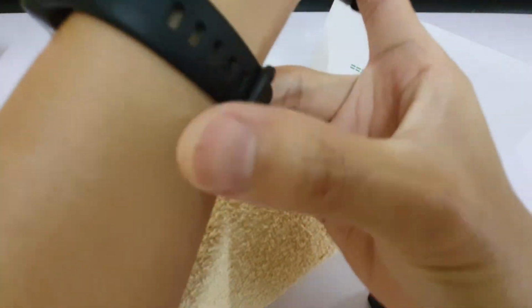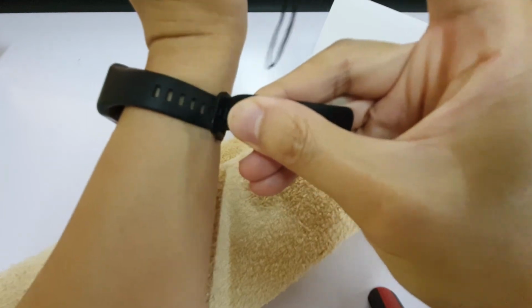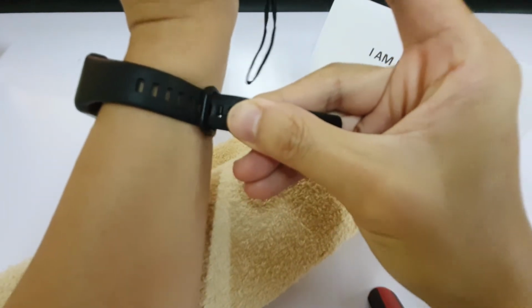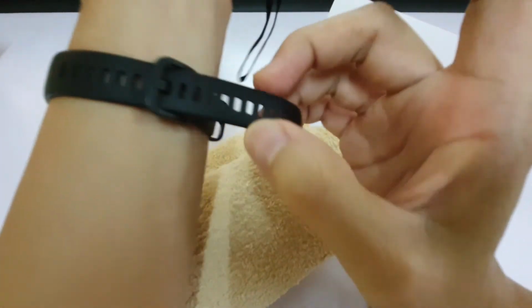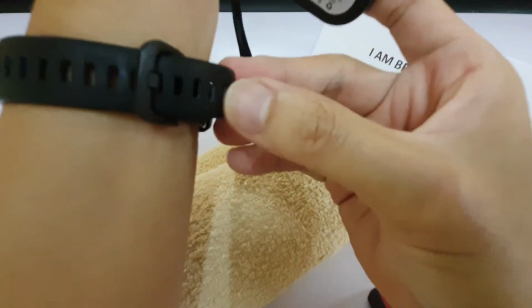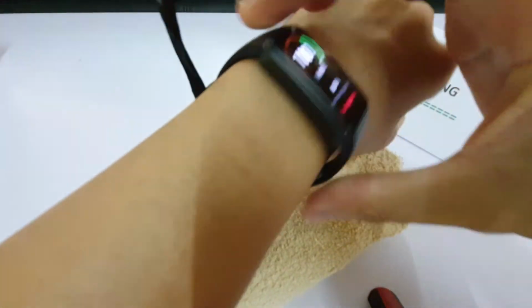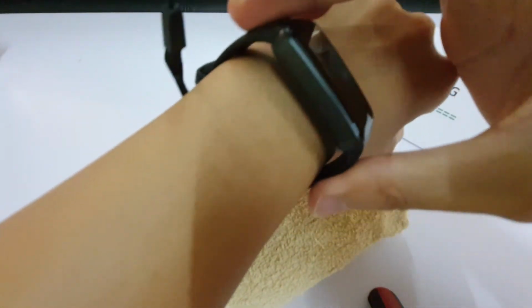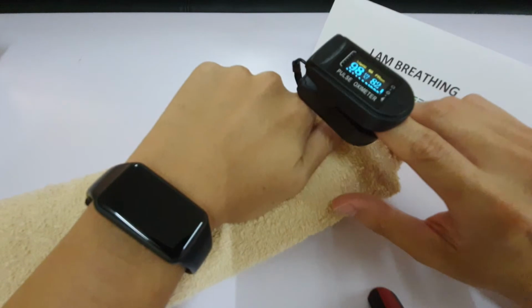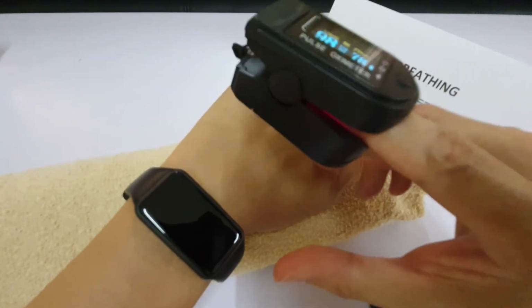Okay, what if I wore it a bit more loosely? And I'll show you the problem with this. If I wear it a bit more loose, like even more loose, like two rungs out. A lot of people may actually wear their bands like this. Just a little loose. And then you'll see the problem with the band. Okay, so right now I'm breathing.